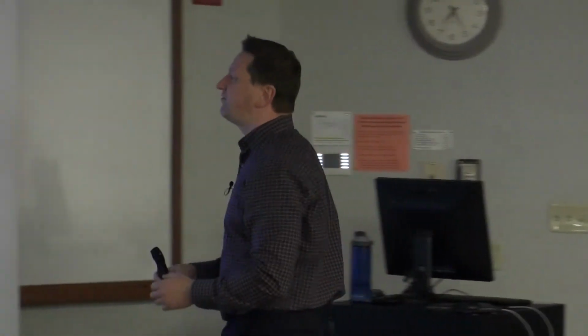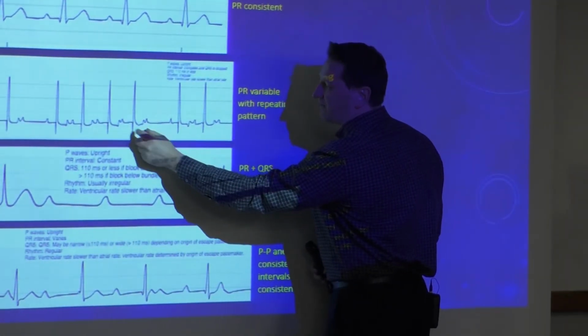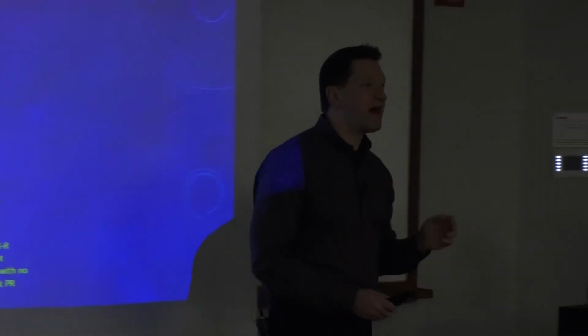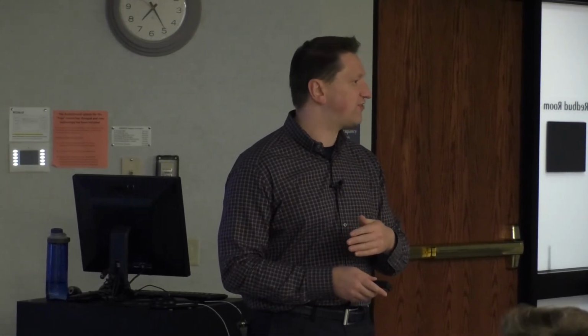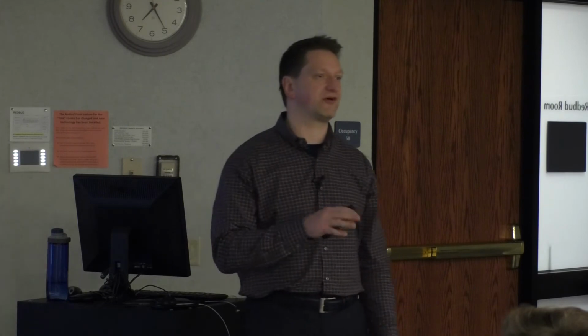Don't spend as much time worrying about the longer. Worry about, is the PR of the very last beat before the dropped P wave longer than the PR of the return beat? If it is, that's how the pros diagnose Wenckebach. The longer thing is not actually required for it to be Wenckebach. It's actually a side effect of the thing that I just told you, okay? If anybody ever wants to know how, I'll tell you, it's fascinating. It's not worth this lecture.